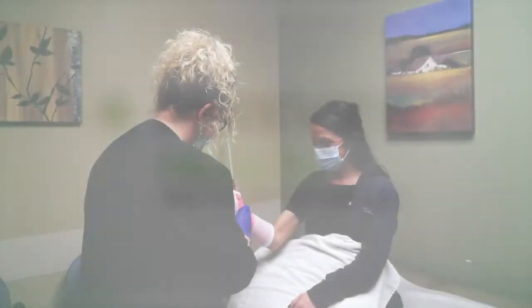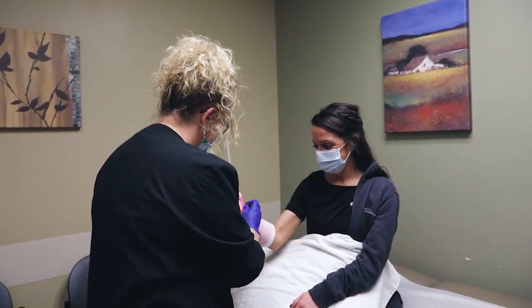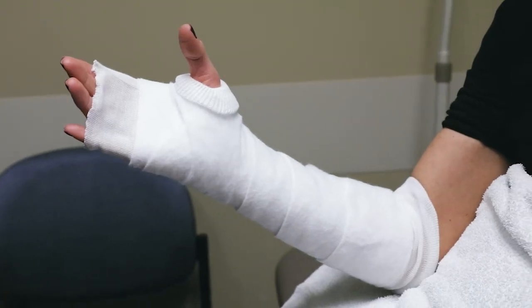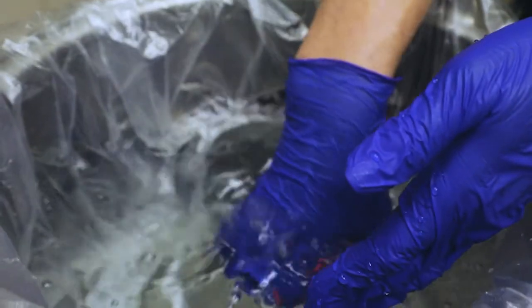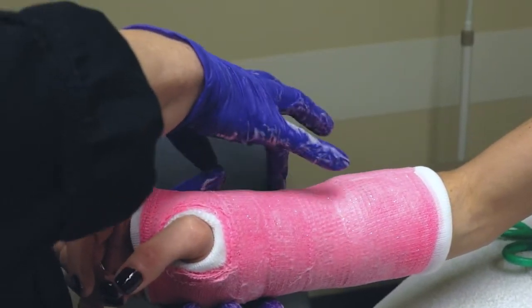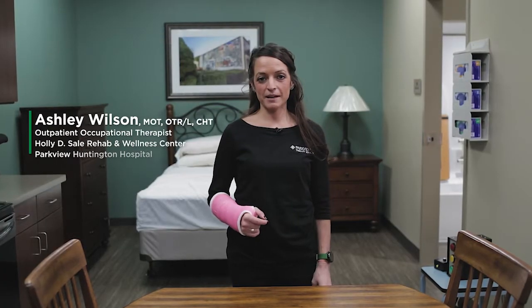The cast is essentially two or three layers. The first layer is a soft sock-like layer that goes on over your injured extremity. Then comes padding, which is a gauze-like padding that they wrap over that sock. And then there is the fiberglass layer — the pink layer that you see here on me — which is a two-layer adhesive fiberglass or plaster layer that they put on.